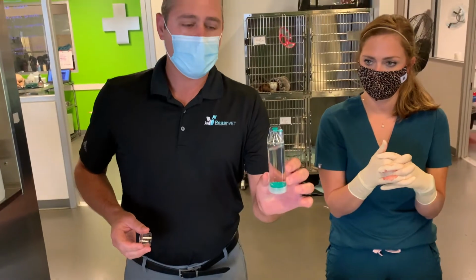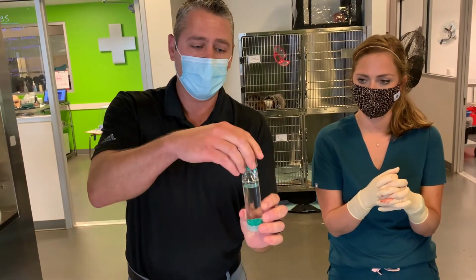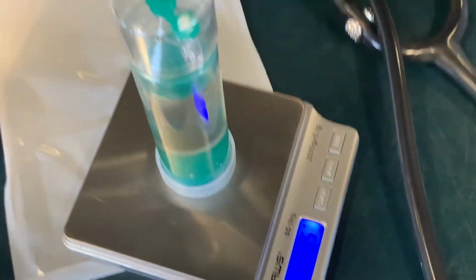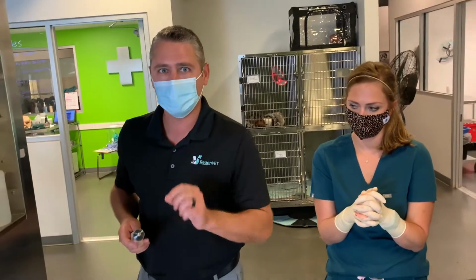So this is the counterbalance. You'll create this one time and then adjust the volume of water inside of it. With the cap on, we're going to weigh this. What are you at? 93.5. Are we at 96? We need a little bit more water in there. How close do you need them to be together again? Within a gram or two.